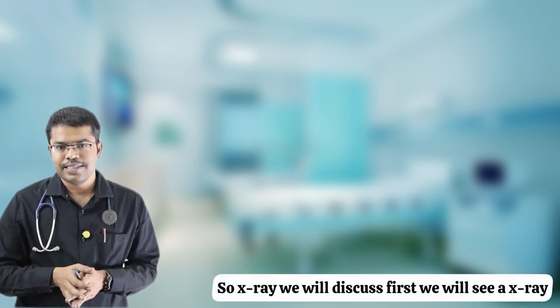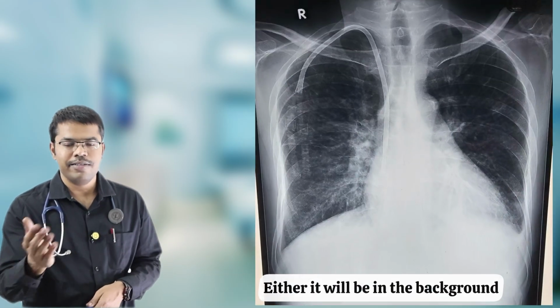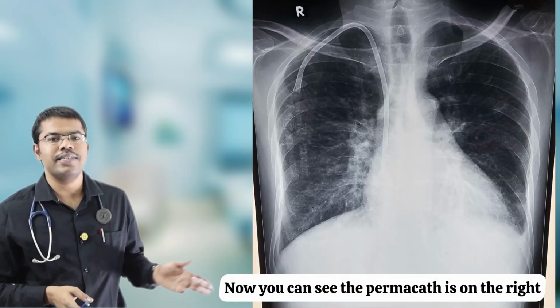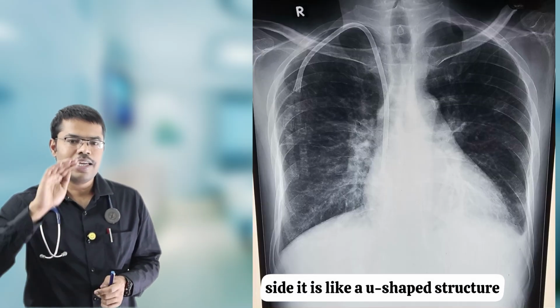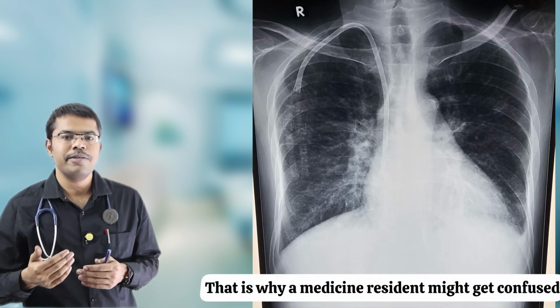So X-ray we will discuss. First we will see an X-ray which is showing the permacath on the right side. Either it will be in the background or it will be on the screen. Now you can see the permacath is on the right side. It is like a U-shaped structure. That is why a medicine resident might get confused.